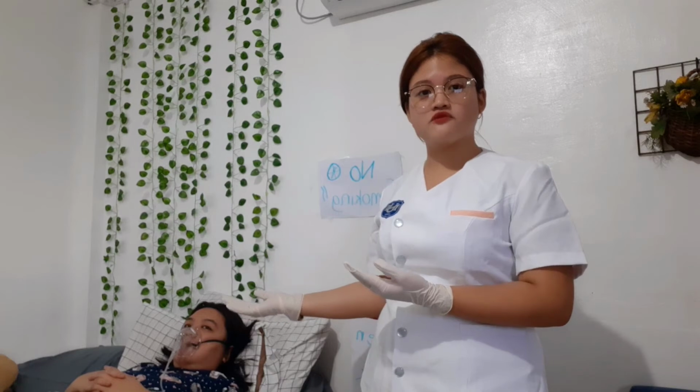Then, for the first assessing in the face mask and face tent, you need to assess the face and ears for dampness, irritation, chafing, dryness from the mask. Treat it as needed. So, what is the rationale? It is in order to treat skin irritation that may develop from the therapy and to prevent further complications.